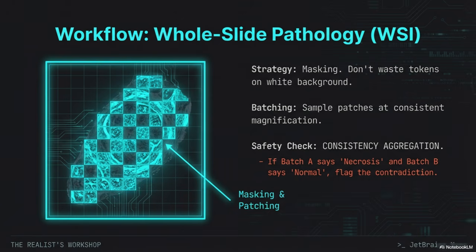And the other specialized strategy is for longitudinal chest X-rays, where MedGemma 1.5 really excels. The prompting pattern here has to force comparison to use that specific training. The simplest effective pattern is structured labeling. So you'd say something like, image A is prior, image B is current. Compare B against A. Output the comparison as one of 4 labels: new, improved, worsened, or unchanged. Then provide a one-sentence impression. This strict templating prevents the model from just describing 2 images separately.